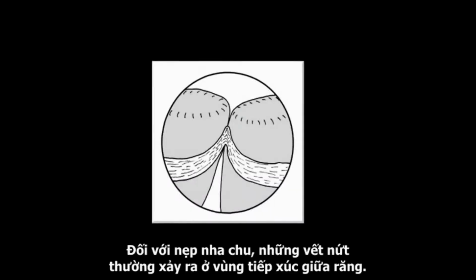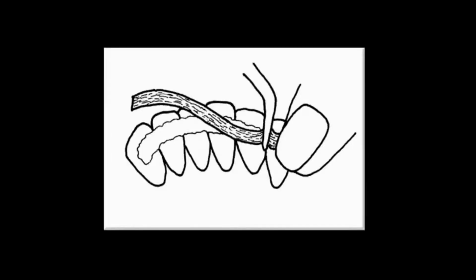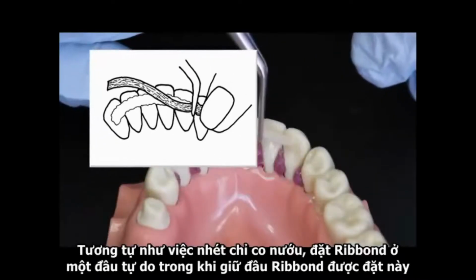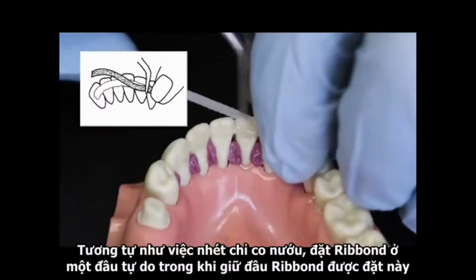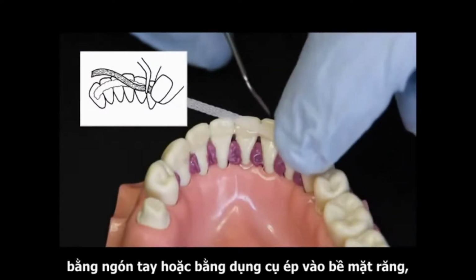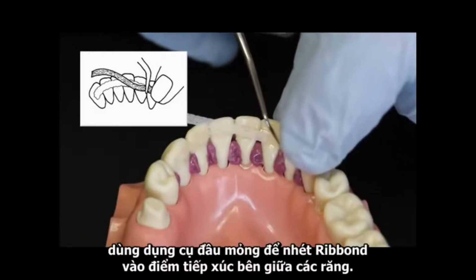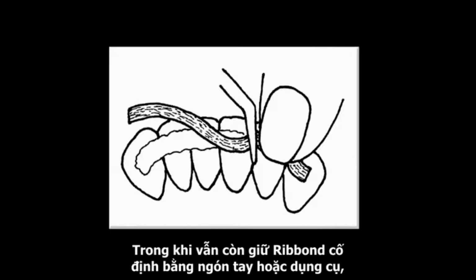For periodontal splints, cracks begin at the contacts. Therefore, try to adapt the ribbon as deep within the interproximal contacts as possible. Like packing retraction cord, adapt the ribbon from the free unadapted end. Hold the adapted section of the ribbon against the surface of the tooth and use a thin-tipped instrument to tuck the ribbon deep into the interproximal contact.